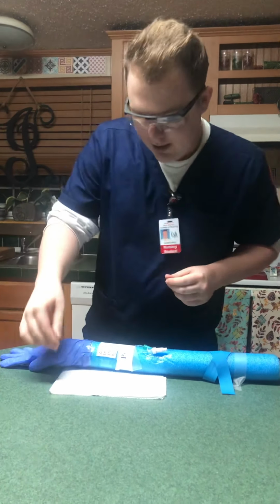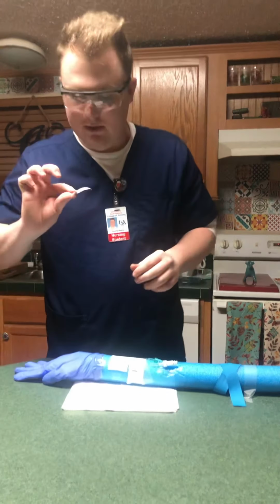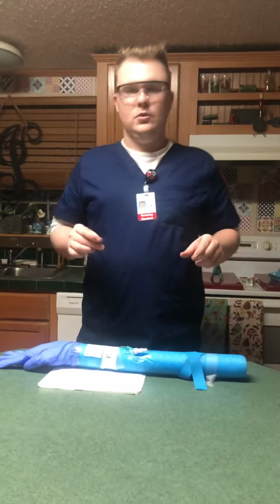And now I could get my piece of tape, my label, and I would put it on the edge of the dressing right here, and I would label this with the date, the time, the gauge of the catheter, and I would put my initials as well.